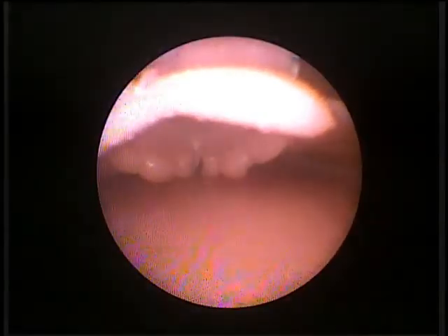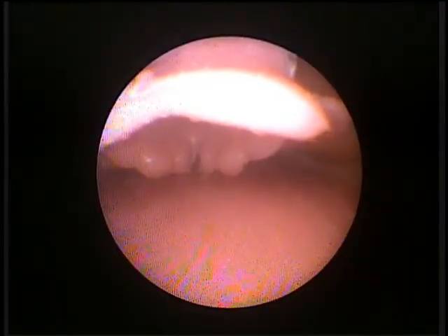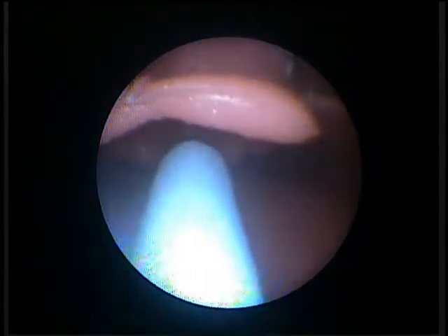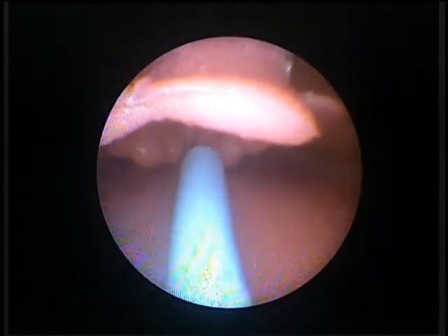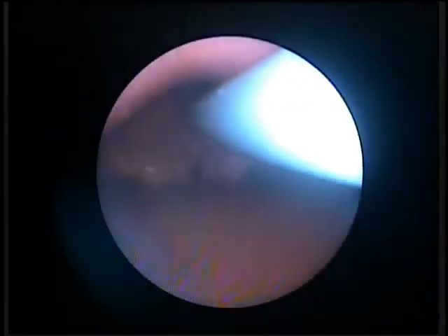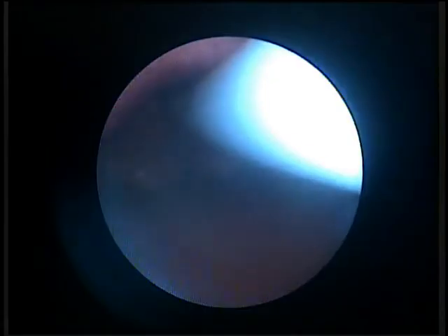Last step: pass the tube. We're going to enter horizontally — you won't see the bougie until the very last second. Now, for the first time, I see my tip. Since I'm entering horizontally, my field of vision is not blocked at all. I look for the notch and I know: as long as the tip goes anterior to that notch, it is in the cords. If it goes posterior to the notch, I know I'm in the esophagus. You enter horizontally; the tip only comes into view at the last second. With tiny finger movements, I can place it behind the notch or in front of it. Even as it passes, I can still visualize my notch — and I know I'm now in the cords.